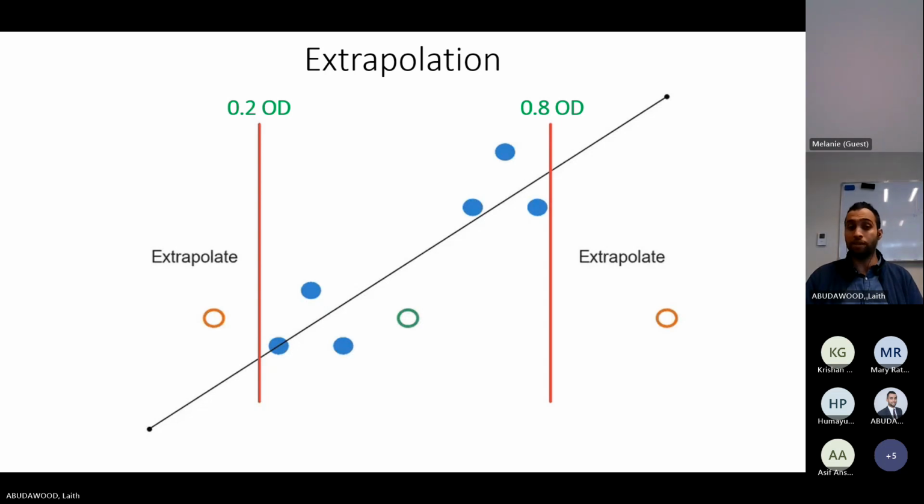So if the analyzer gets a value outside of my calibration bounds, it will not be able to give you any concentration. Even if you enable extrapolation, the analyzer cannot extrapolate second or third order polynomial calibration curves. Linear or hyperbolic, such as antithrombin 3, for example, is a linear calibration curve.